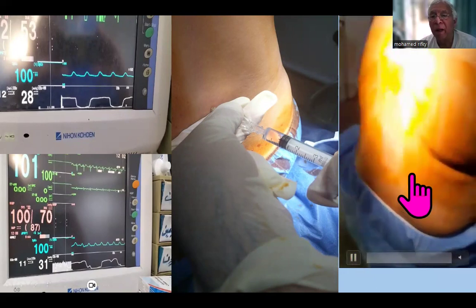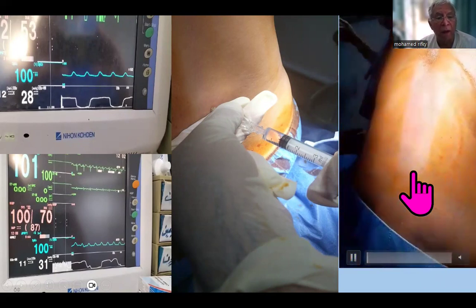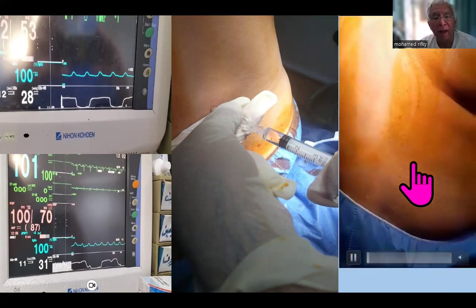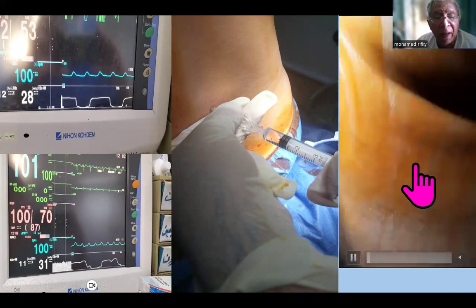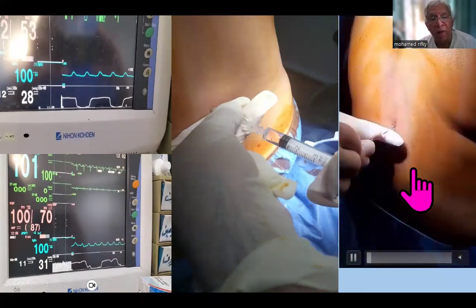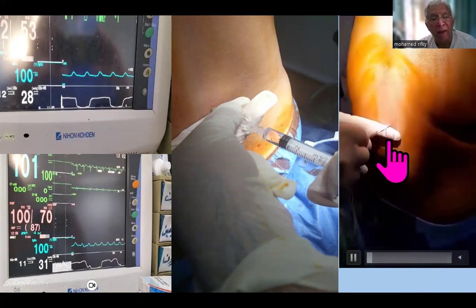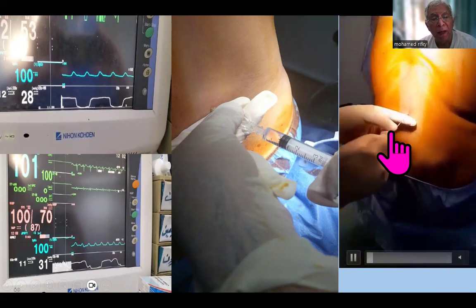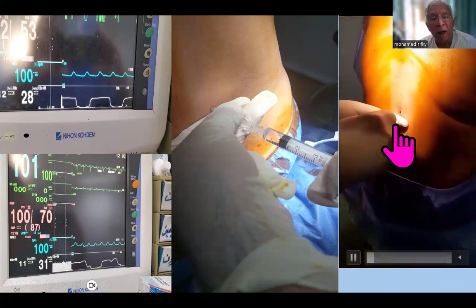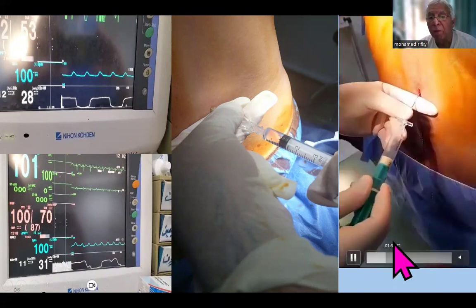And this is epidural analgesia. Epidural is a larger needle, as we saw before. And the advantage of it, of course, is that we can introduce a catheter, so we can maintain the analgesia for 2 days, 3 days, or whatever. So I am trying to introduce the needle between the two spines. Of course, I'm hitting bone all the way till I reach the space between the lamina above and the lamina below, where I can go through the proper site.